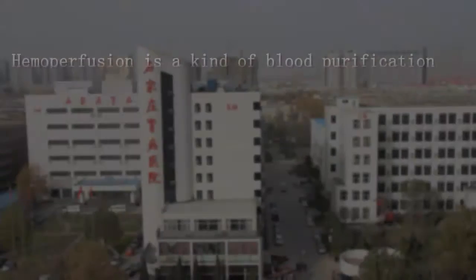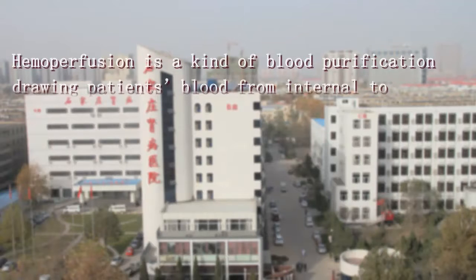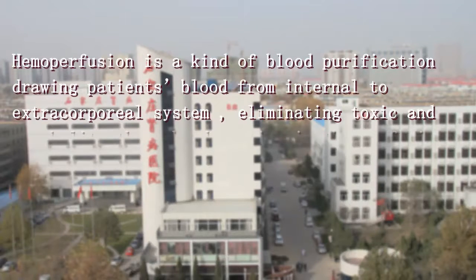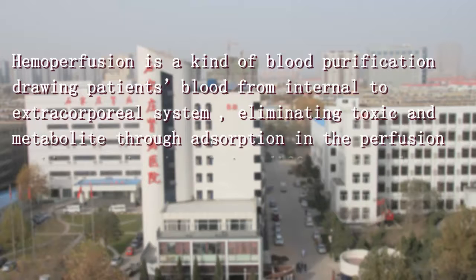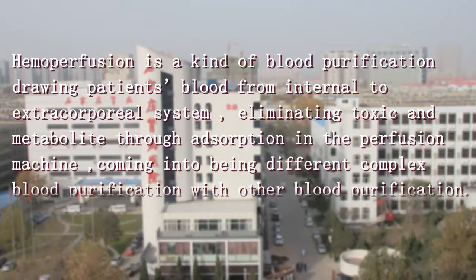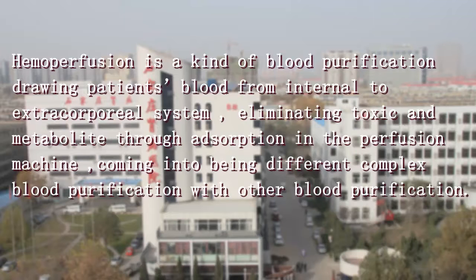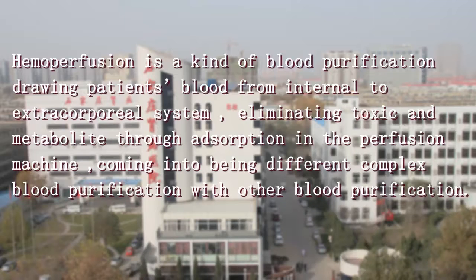Hemoperfusion is a form of blood purification, drawing patient's blood from internal to extracorporeal system, eliminating toxins and metabolites through adsorption and a perfusion machine, forming a complex blood purification process combined with other blood purification methods.